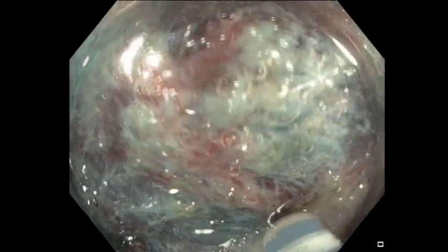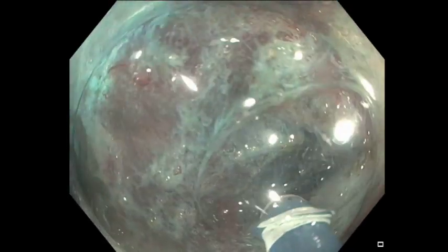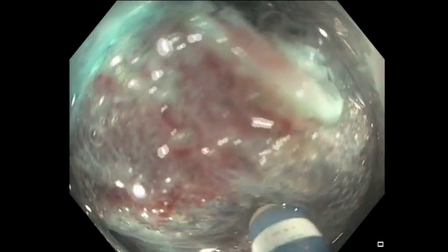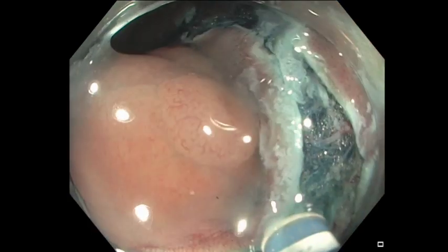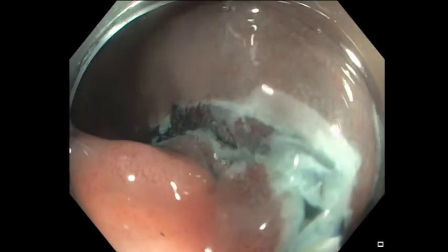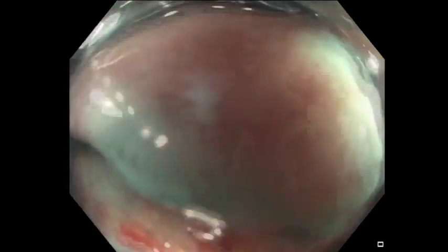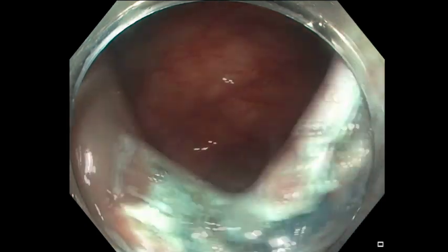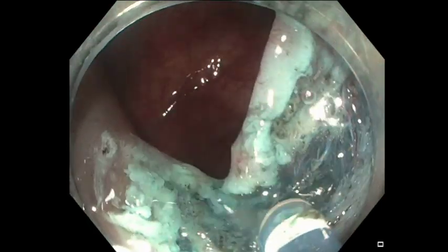And now I'm going from the right to the left side, ensuring that we open it, and I'm dissecting just above the muscle layer because now we are under the lesion. You can notice that granular lesions have a good blood supply. And you notice here, I'm ensuring to dissect the right margin of the lesion. The right margin is in a different plane. Most of the lesion is in one plane, which is at the lower end. However, the right side is going up to the side, which means it's another plane, so you have to gradually dissect it.